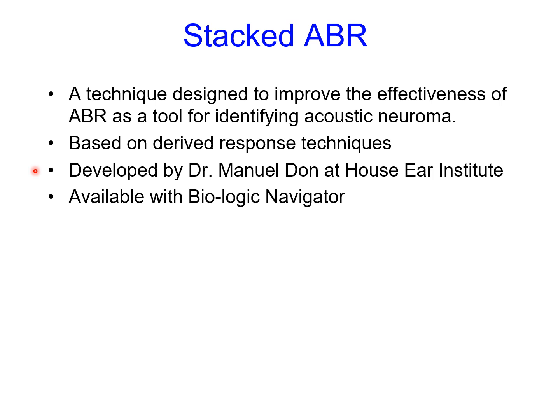By now you probably know that I admire Dr. Manuel Don quite a bit because he has invented several algorithms that are very useful in our field. This technique is available in the Biologic Navigator commercial package.